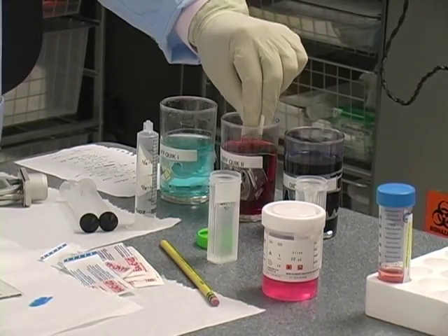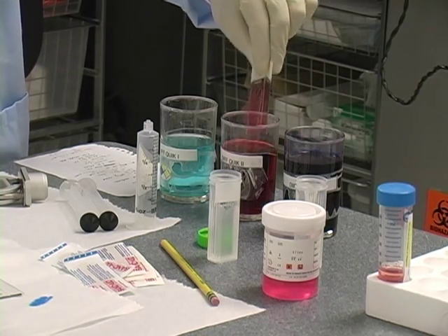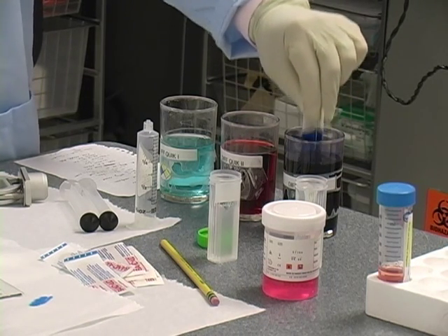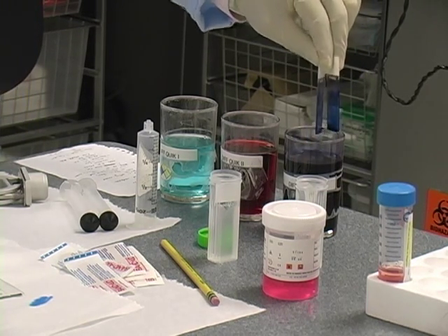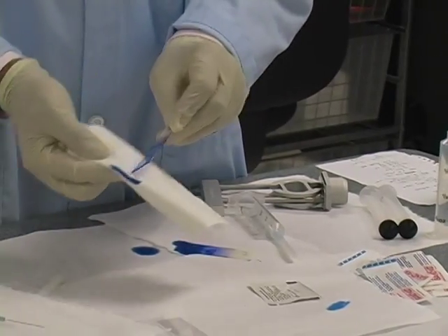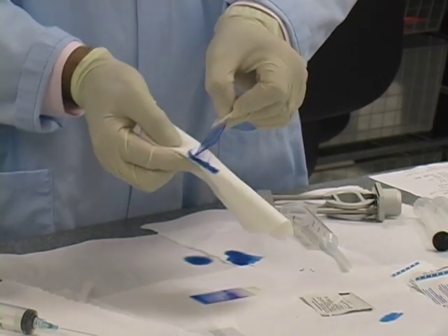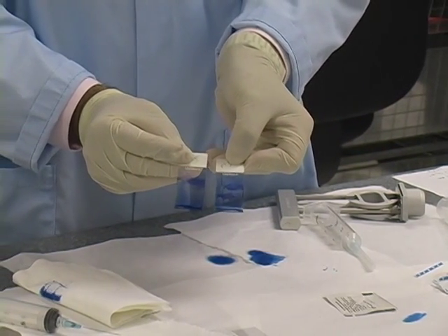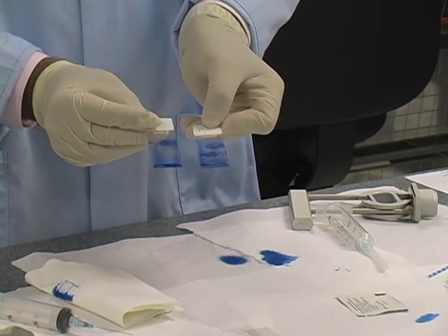Third solution. You can see on this one I have quite a bit of material that I've aspirated. My Diff-Quik stain slides are done. You can also use the hair dryer to air-dry these — to dry some of the stain off before you put them in the cardboard.